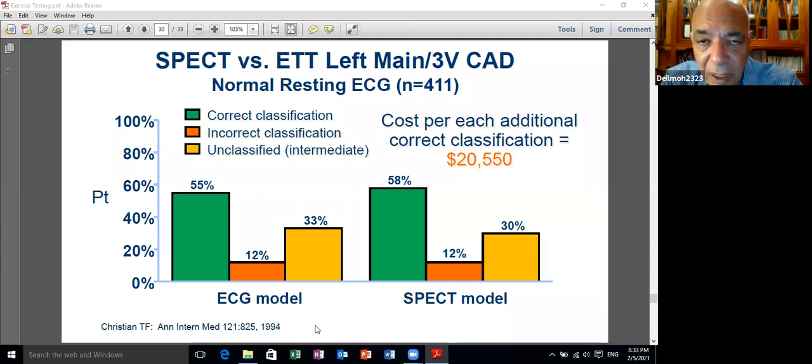نفس الحكايه في النيوكلير، لازم تبص في كذا صوره جنب بعض. لازم تبص في 3 ليدز وتتاكد ان البيز لاين بتاعهم كويس، وتتاكد ان التشينجز في الاس تي سيجمنت كونسيستنت في الثلاثه. اي في ار ما تقدرش تتاكد منهم الحاجات دي. فحكايه ان في سبازم في الرايت كورونري ارتري appears in AVR is not logic.